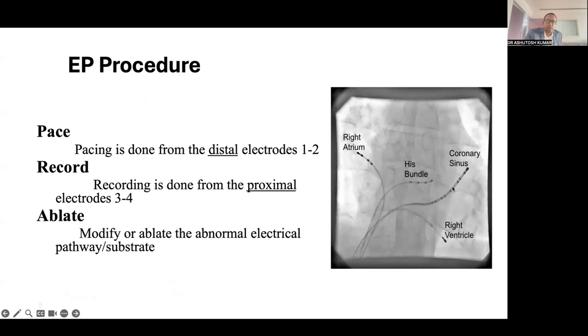These electrodes will be numbered from one, up to down, and usually the convention is that numbering starts from 9 to 10. 9 to 10 is proximal, and 1 to 2 is distal. Like that, we will be monitoring where the signals are coming from.